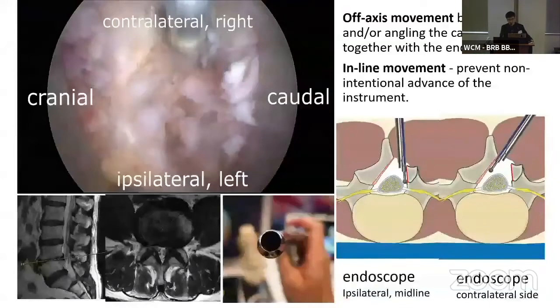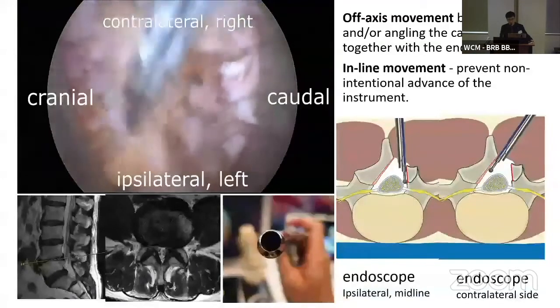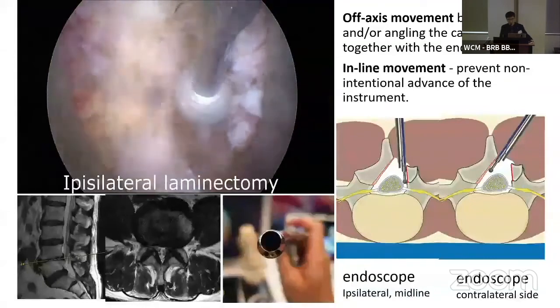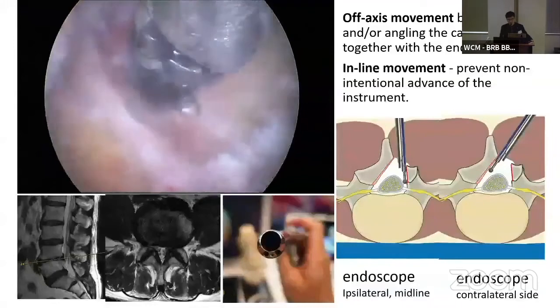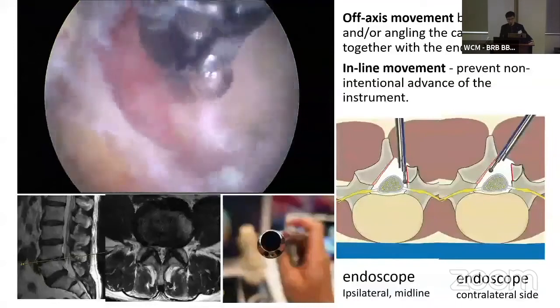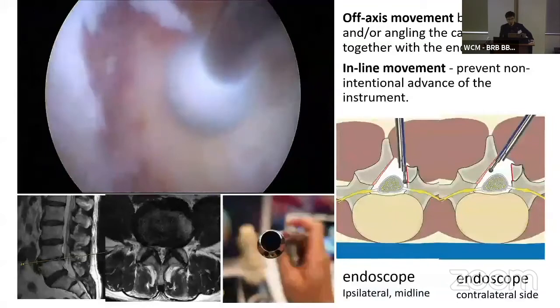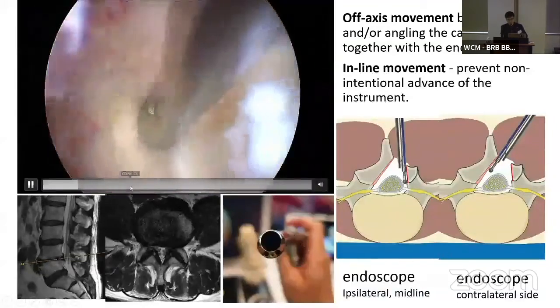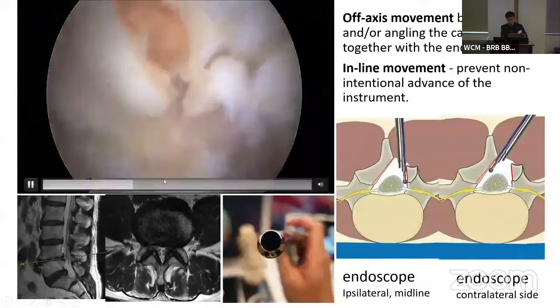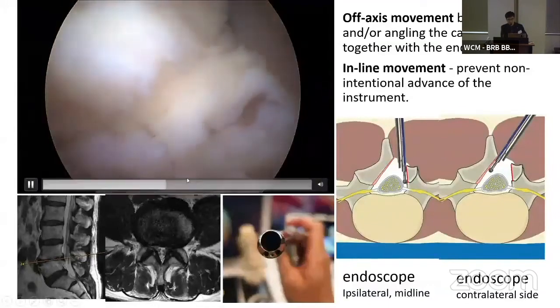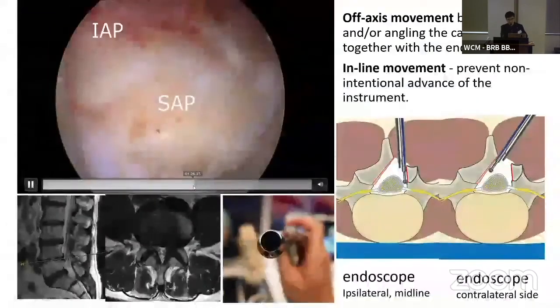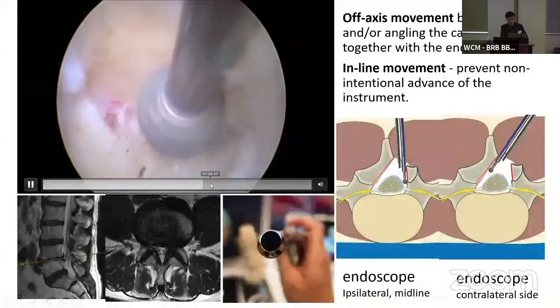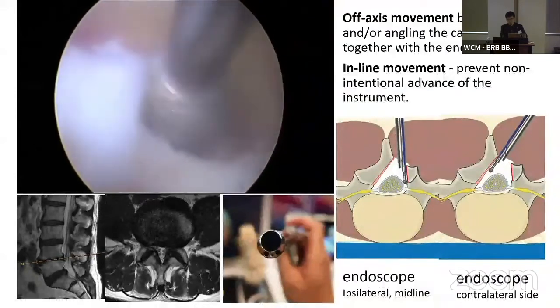This is an example of lumbar endoscopic ULBD. The starting point — the inferior medial cranial edge of the lamina — is already exposed. We can start the laminotomy from the cranial side using the straight type and T-control type. And then we can move to the midline portion for decompression. The outer layer of the ligamentum flavum is exposed, and then we can start working the contralateral side from cranial to caudal.